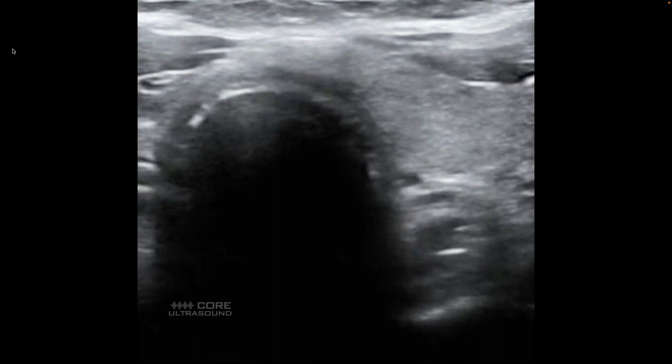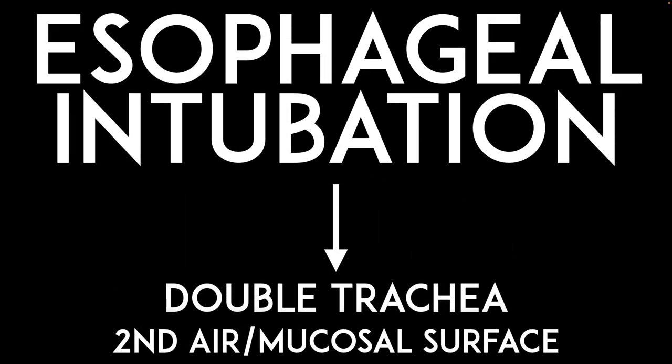Now that we've reviewed what a normal trachea and esophagus look like on ultrasound, let's focus in on exactly what we're looking at when things are going wrong - namely, how to identify an esophageal intubation, which most of the time is not what we want. The appearance of a sonographic esophageal intubation: we're basically looking for a sign that these two things are the same. You either look for a double trachea - it looks like there are two tracheas rather than a trachea and esophagus - or you look for a second air mucosal surface and see if that thing is being manipulated with the ultrasound.